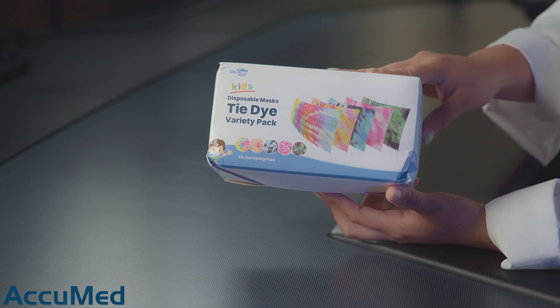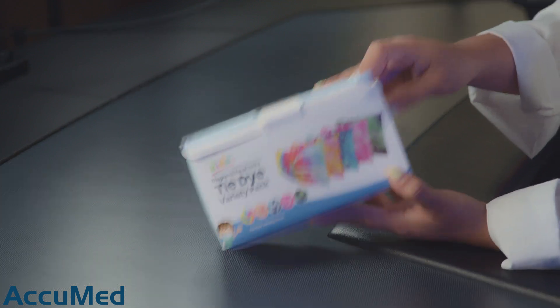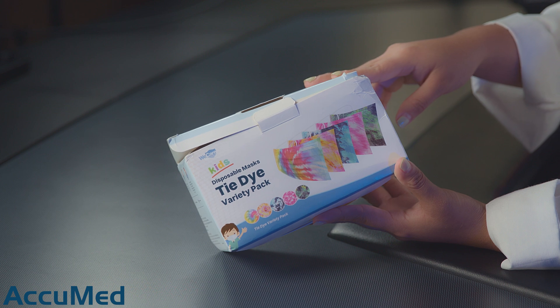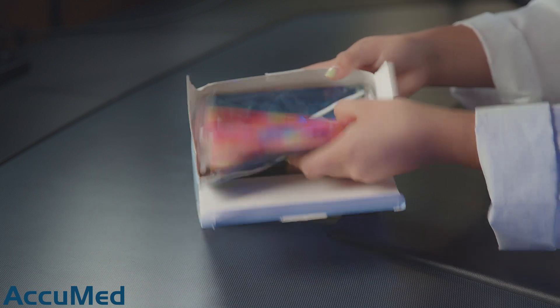So this is how the packaging looks. On the actual packaging, it doesn't have any sorts of claims when it comes to the ASTM level or anything of that sort. They are individually wrapped and they have a variety of prints.